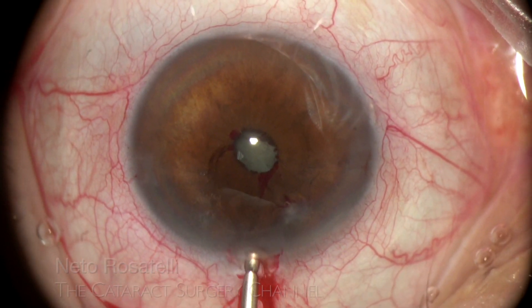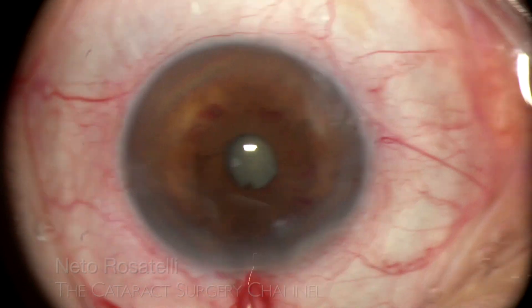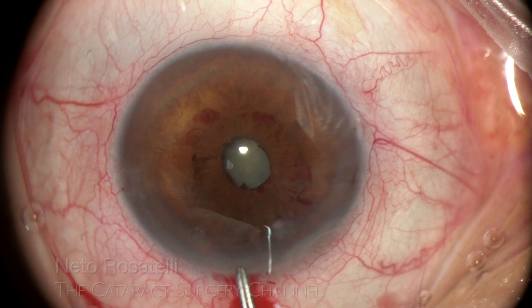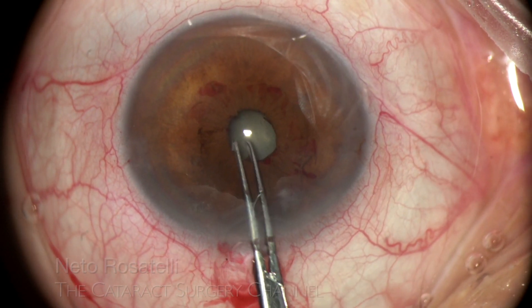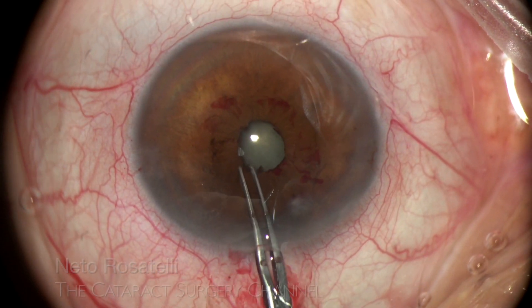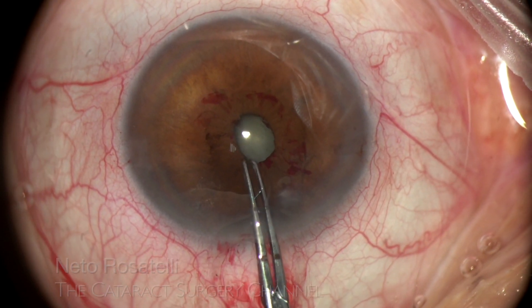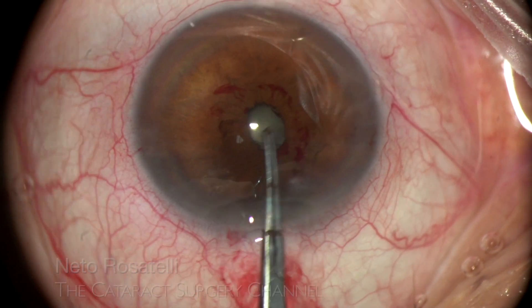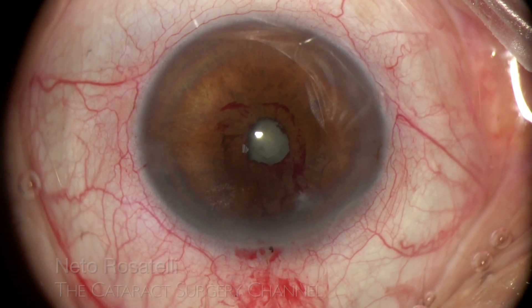It is very important to be sure that no significant amount of fibrotic tissue is left behind, or it will limit pupil dilation and lead to an iris radial tear. The pupil is now elastic again and able to be easily dilated.